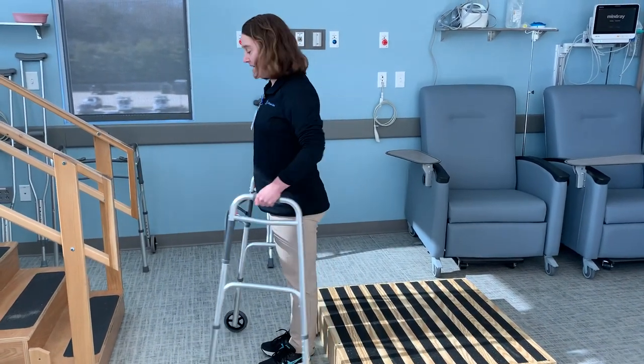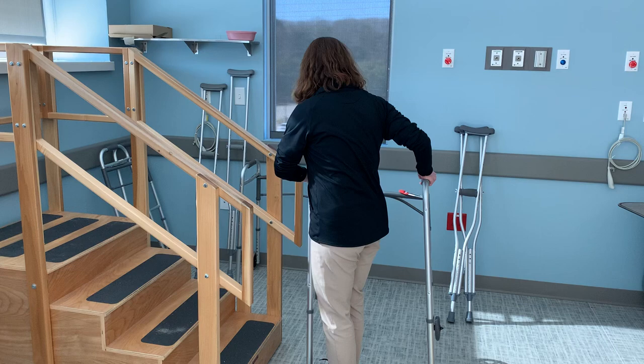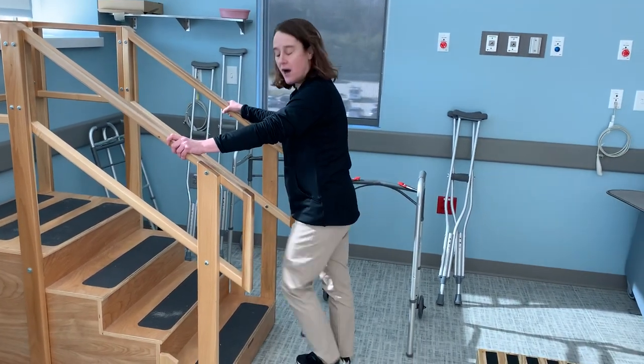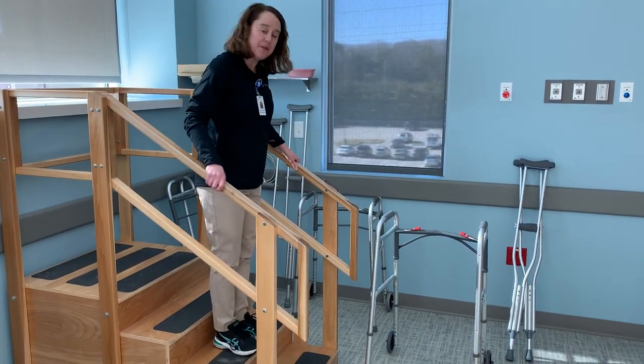When you're using stairs, you need to have a family member bring your walker up to the top so it's waiting for you. If you have two railings, you'll hold on to both, and you're still going up with the good leg. When you're coming down, you will go down with the bad leg.